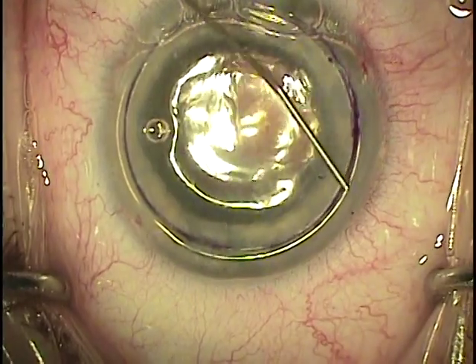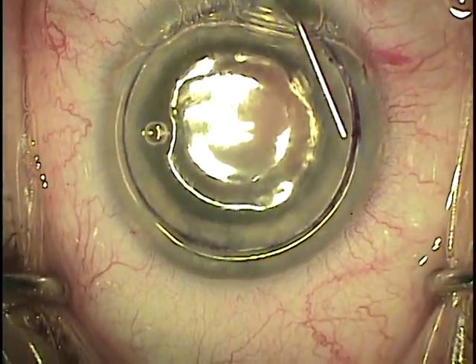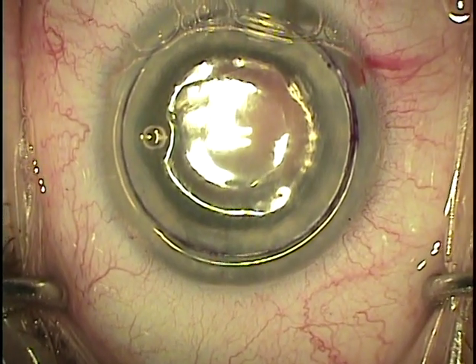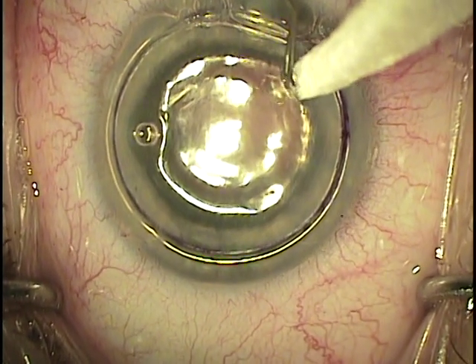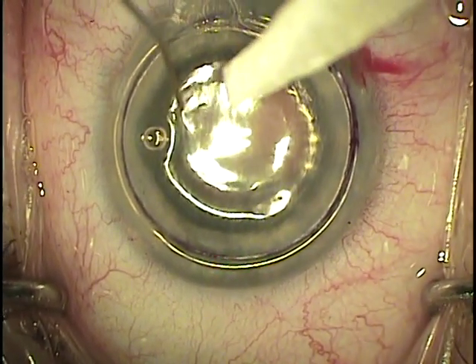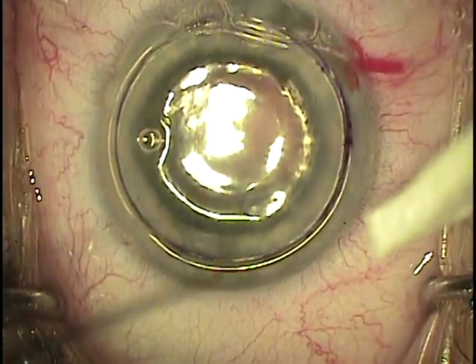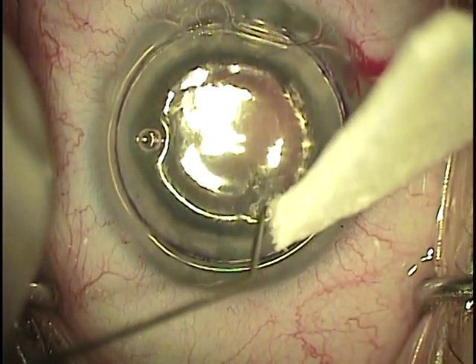The bubble pressure should ensure a tight anterior chamber of at least 20 millimeters of mercury. Lastly, the paracentesis stab incisions are drained with the same 30 gauge cannula and the aid of a Weck-Cel sponge. This removes any interface fluid, reducing dislocation rates. The patient is then sent to the recovery room to lay supine for one hour, at which time part of the bubble is burped to ensure no pupillary block.